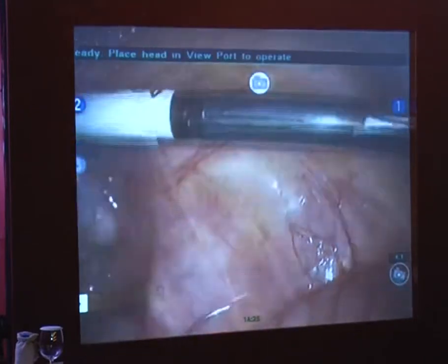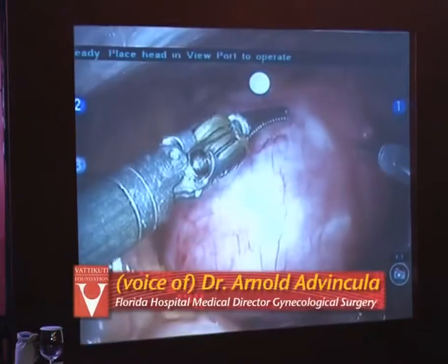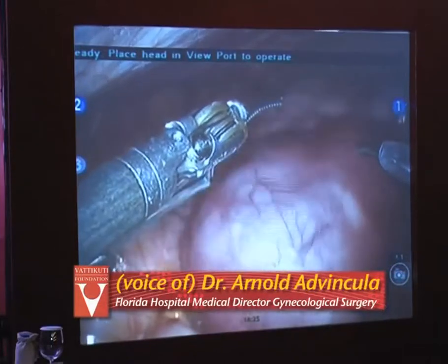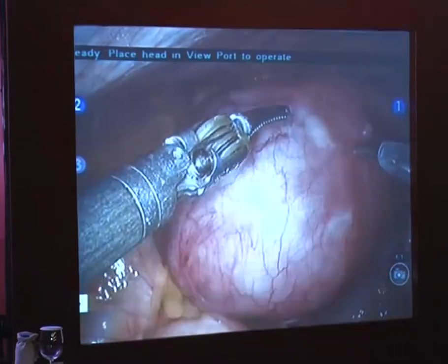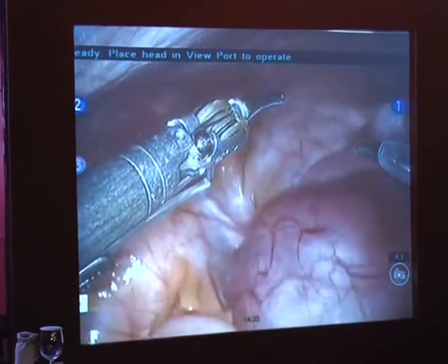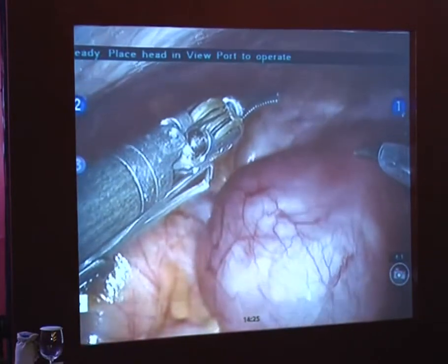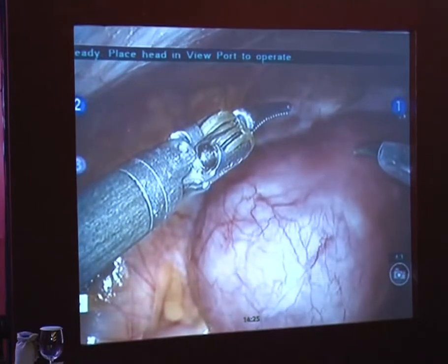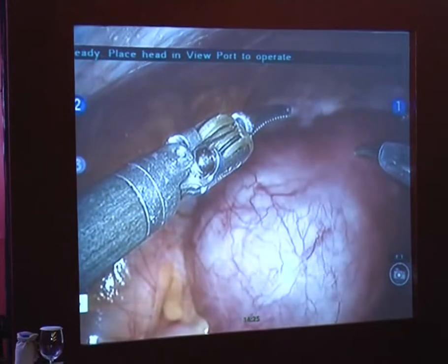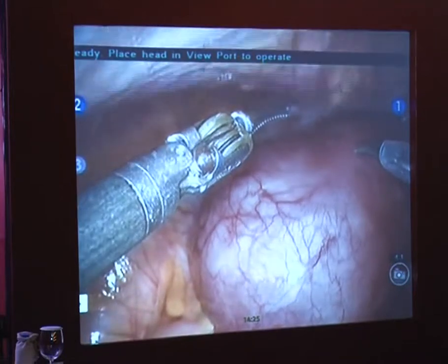What's your recipe for your dilution? I typically utilize 20 units in 50 cc's of saline. So we have a 40 unit vial here, so it's diluted in 100 cc's. As you know, there's no real magic to the dilution. You just have to choose your own surgical preference. And be careful not to have it intravascular so that you don't end up with cardiogenic shock. Had that happen once in my career, and I really would rather not have that happen again, because that's always a very disconcerting feeling when you see that happen in a patient. I'm going to go ahead and situate the tenaculum here.